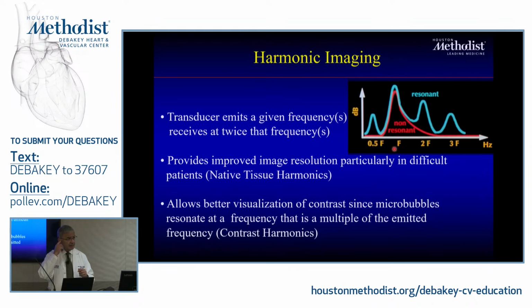An example of that is if you're a piano player or a string guitar player, you can hit it hard, and it actually emits, beyond the beautiful, nice monotonic frequency, multiples of it. And a simulation with my voice is, right? So different frequencies of it, and that's important.